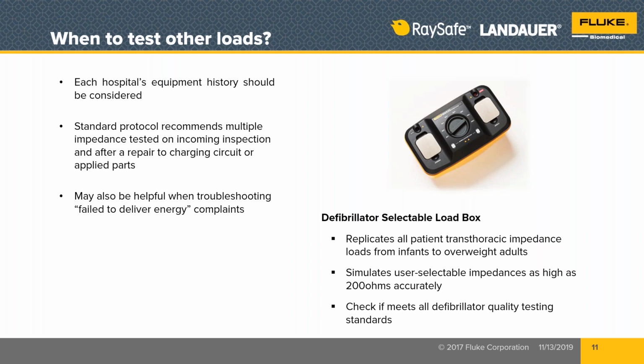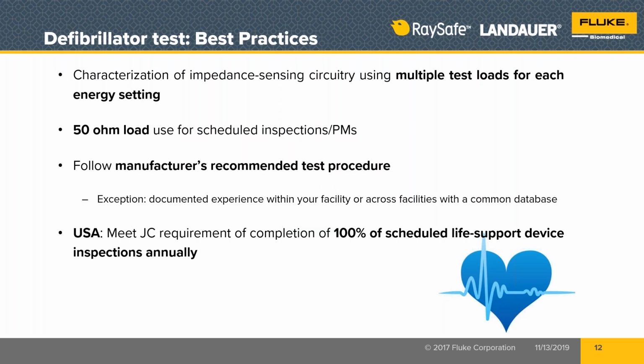But if you just did a repair, even if all you replaced was the battery, you need to retest. And again, I'm not talking about AEDs so much, but I'm really very much talking about full ACLS defibrillators. If you replace the battery or the capacitor or any part of the charging circuit, you need to repeat these tests to ensure that that functionality of the output energy guarantee is really still there, that you didn't interrupt it, that you didn't do something to prevent it from working properly. Okay, so we've already talked about this. I don't need to talk about it a lot more.